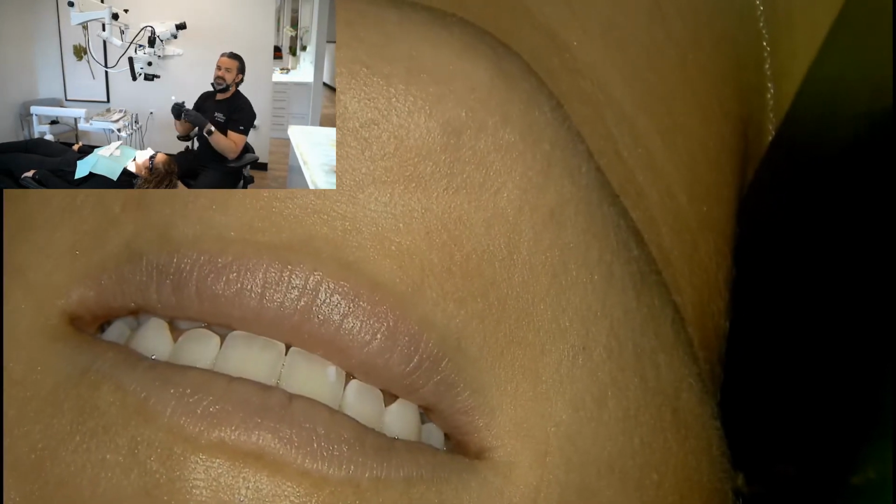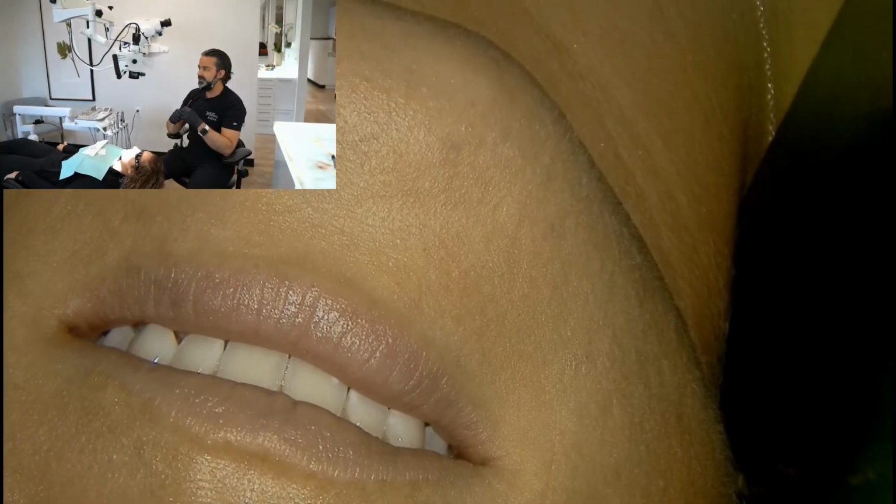And that's true with any light, right? That's not different than the LED lights you use on your loops. So you could do a loop, a video hybrid if you wanted a scope just for video documentation. Back to the question on that room feed, that's really like this LED screen that I've got here, or a projector, whatever you're into. That's really just up to your working environment.